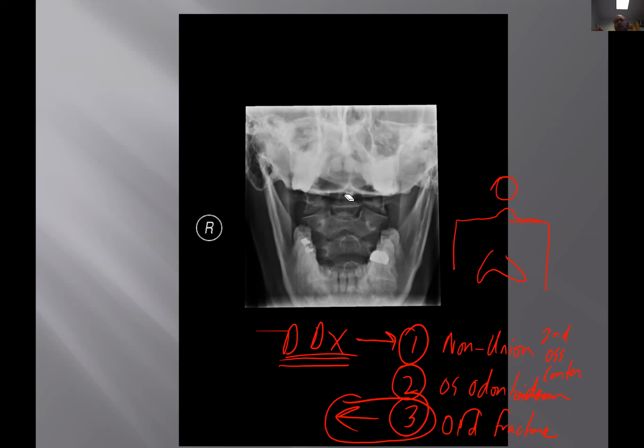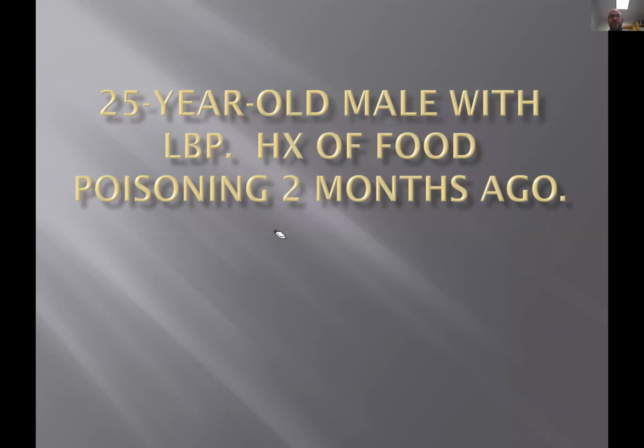Yes, you could look for a big ADI space, but chances are the transverse ligament is just fine. Yes, you'd look for that, but what you're really looking for is if that dens slops around. If C1, if that dens slops from flexion extension on top of C2 at that interface, is that interface hunkered down with the kind of fibrocartilage? It looks lucent. What's in there? Is there something still holding it together, or is that going to be unstable? But yeah, definitely look for the transverse ligament. It'll probably be intact, but look for instability at that segment.